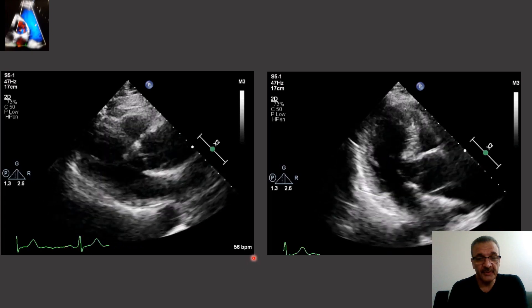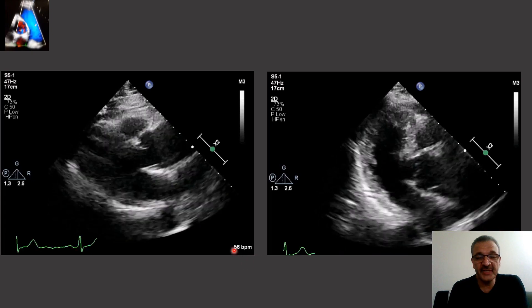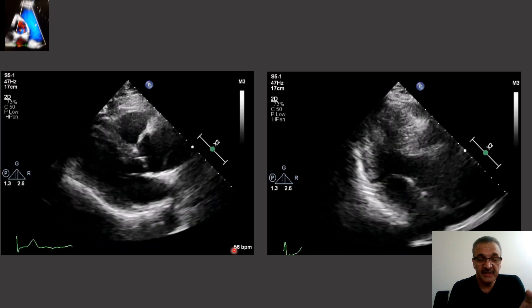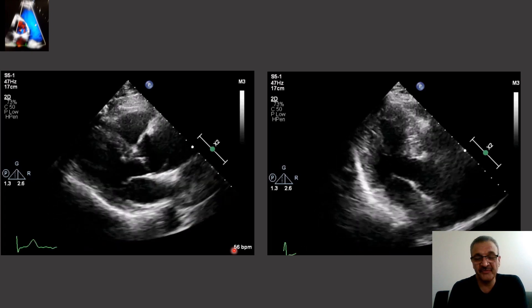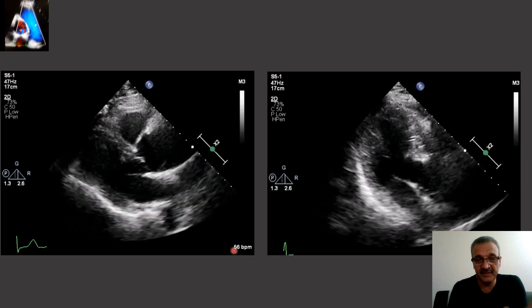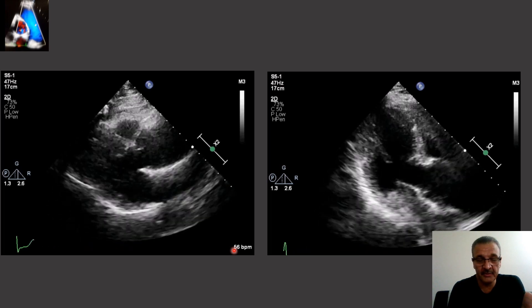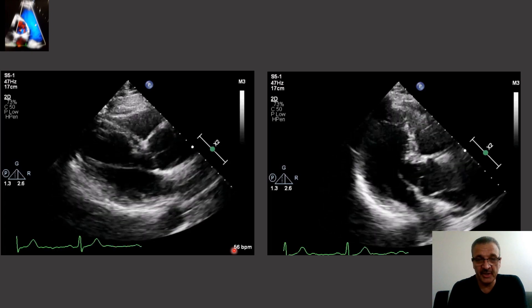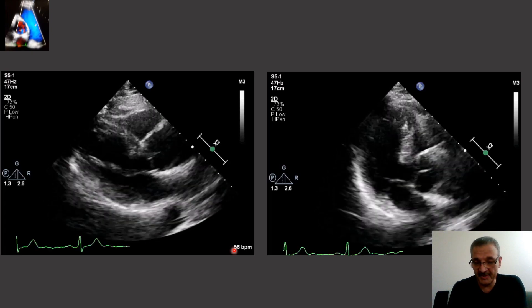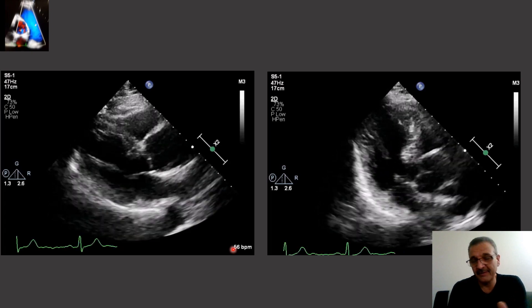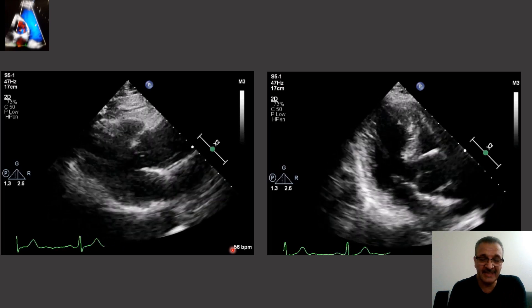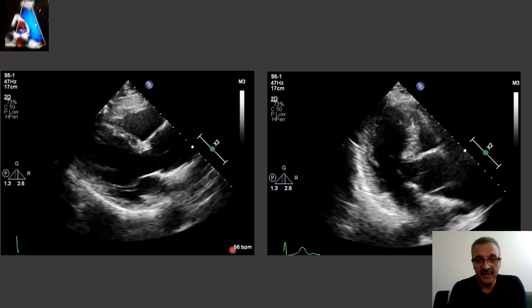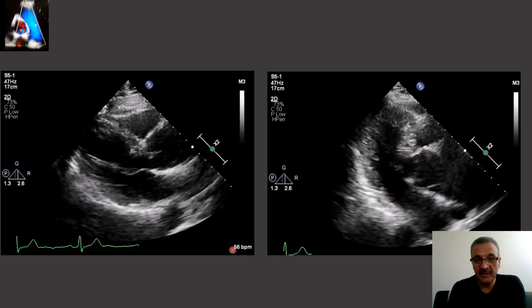Now let's see how we can detect dissection of the aorta and how we differentiate it from artifact. Because in the ascending aorta and aortic arc, if there is any pathology, we have almost only dissection of the aorta or artifact — of course, except for the Impella or other intra-arterial catheters.